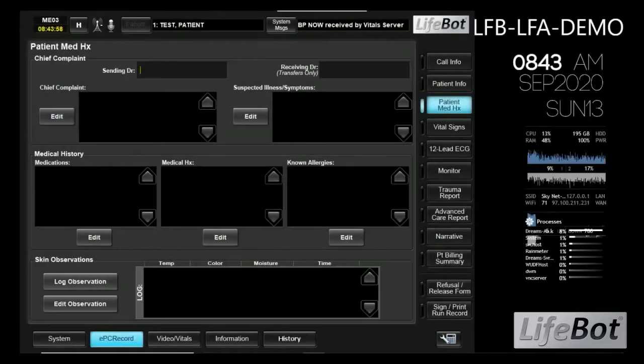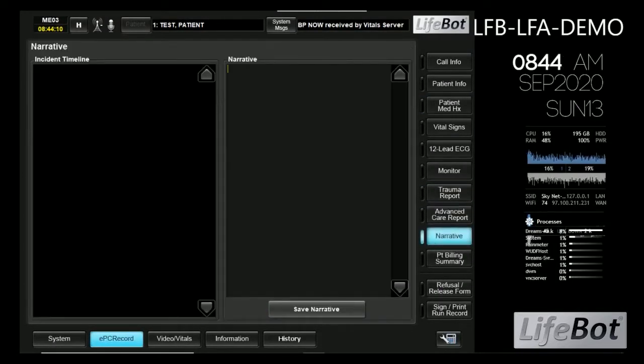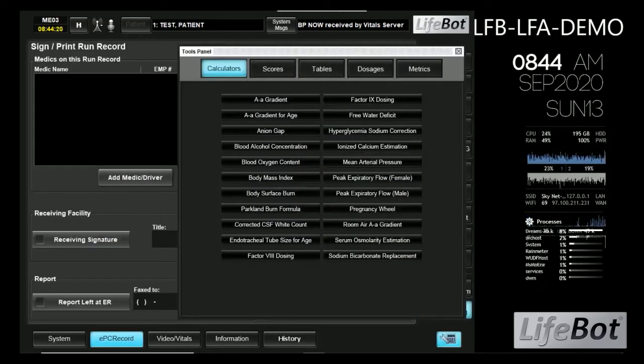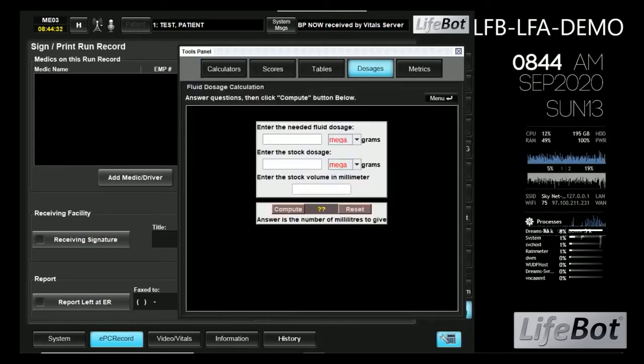There are many other data capture modules in the software that collect information about the current call, including trauma reports, advanced care reports, patient billing, and release forms. The software also features an array of medical scoring indices and calculators to assist the paramedics during the call.